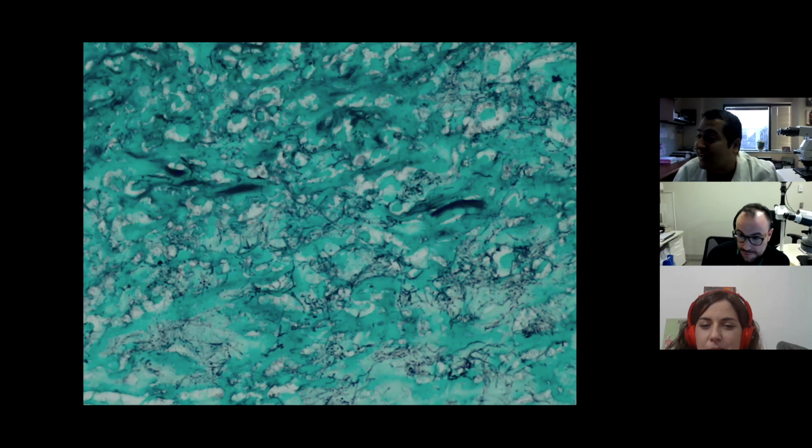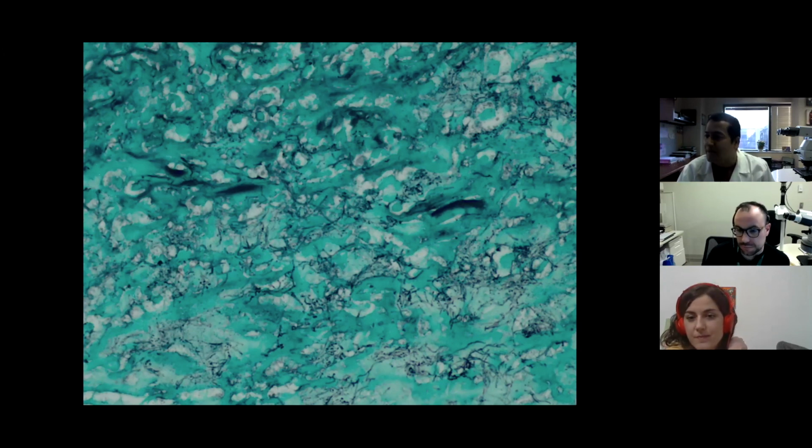This is actually Nocardia. Oh, Nocardia. And the thing that I keep reminding people on Twitter, and wherever I've presented this, people agree with me, is that in tissue specimens, so formalin-fixed paraffin-embedded histology specimens, GMS is a much better stain for Nocardia than AFB is. It almost never stains with AFB. But in microbiology and on cytology specimens, like fresh, unfixed specimens, these things are AFB positive. Cool. Very helpful to know. An AFB positive thing in a brain, you should always be thinking of Nocardia.